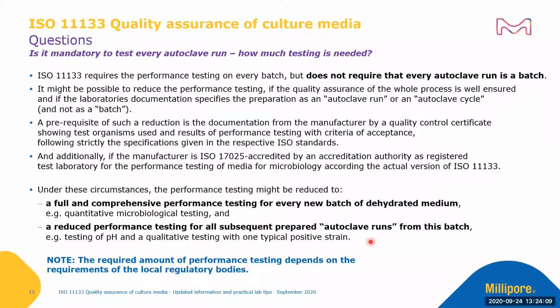It is very important to note that the required amount of performance testing depends, of course, on the requirements of the local regulatory bodies, which may vary from country to country, from accreditation body to body, and from area to area.